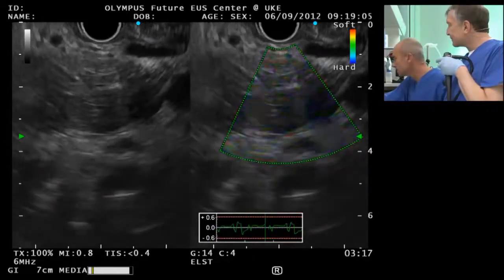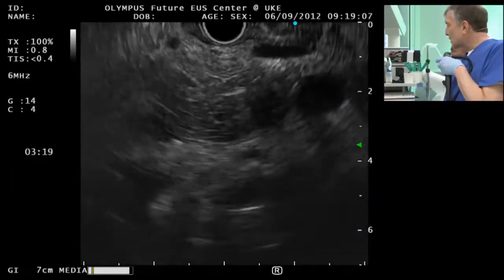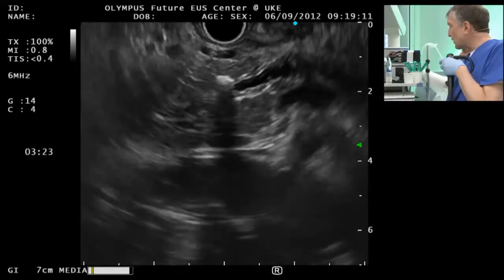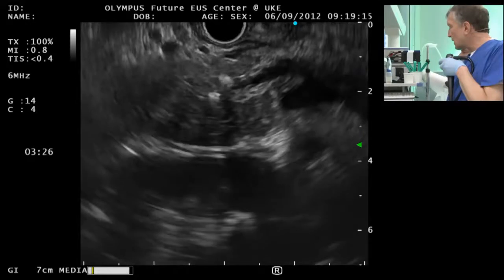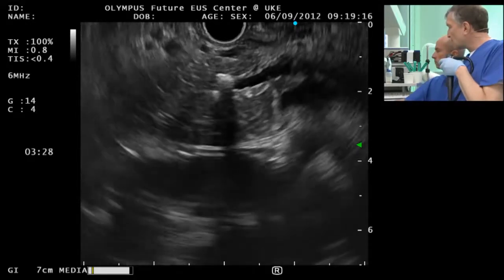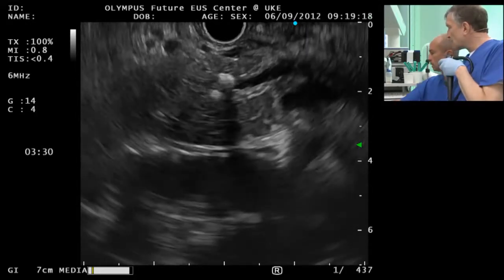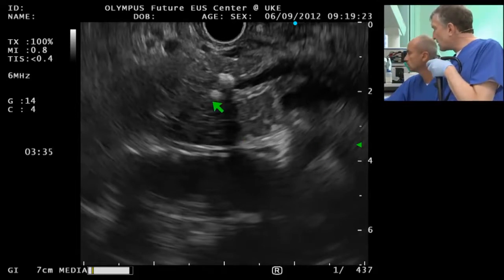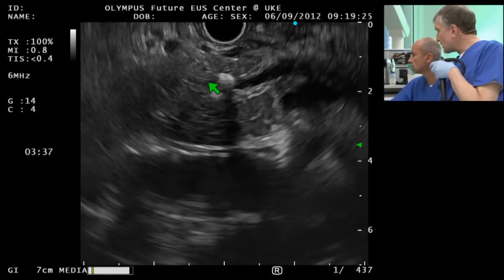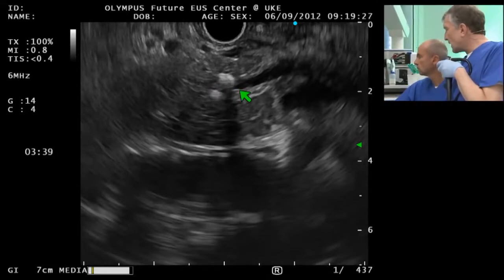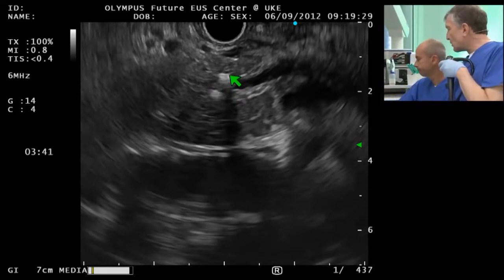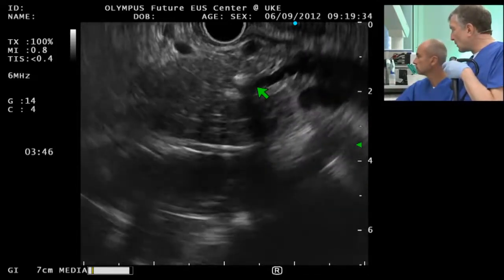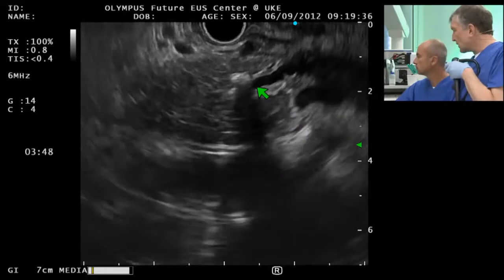So we are basically done. Here we see a clear picture of chronic pancreatitis. Here's the stone again, obstructing the duct. I'm not sure whether it's in the duct — as we can see, at least the upper one is a calcification outside which seems to compress the duct. So that also has something to do with whether ESWL will be successful, which I doubt.